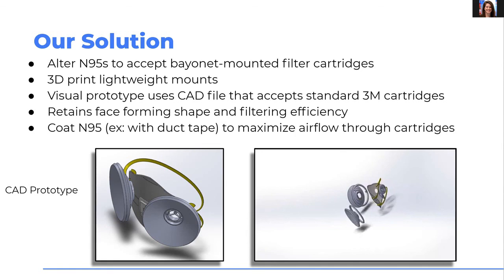But it should be fine even with scissors. Okay, thank you. So I have a clarification question. Do you plan to have the physicians and nurses do this themselves and assemble it themselves, or are you going to assemble it outside and then deliver it to them already assembled? Honestly, either one. The whole goal is that we could reuse old N95 masks, and the old N95 masks would be at the hospitals. So ideally, the modification would be done at the hospitals, but it could also be done ahead of time and sent to the hospitals.